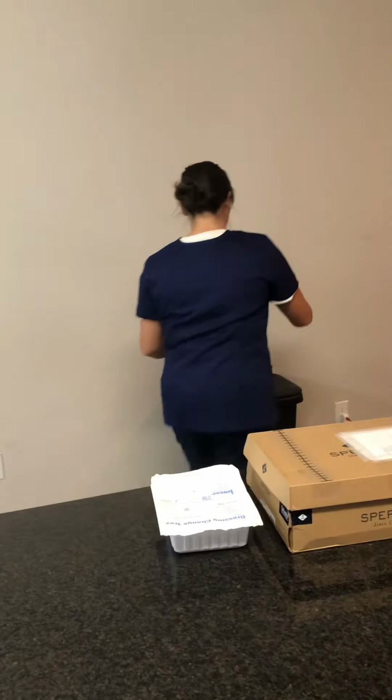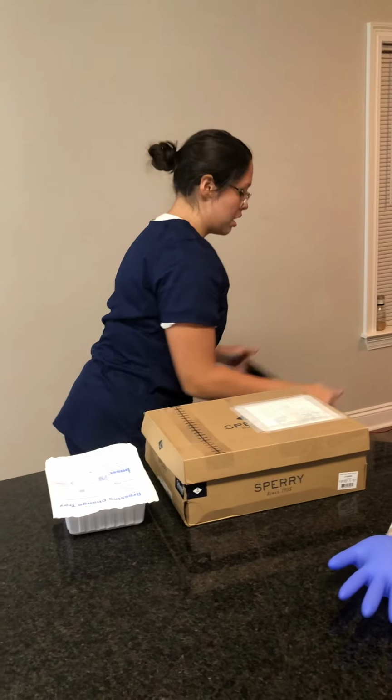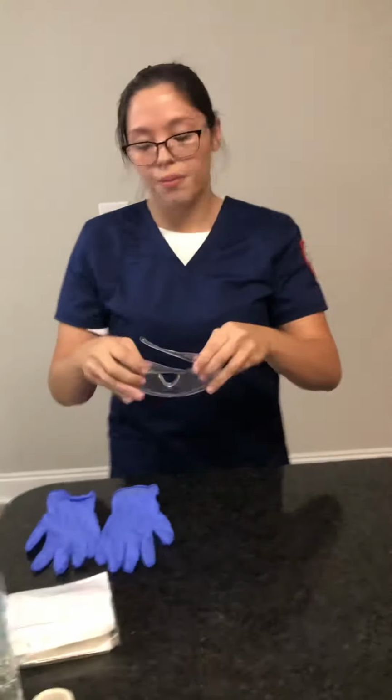I will then get my trash can and bring it to my work area and perform hand hygiene with the antiseptic hand rub. I will then heighten the bed to a working height and lower the side rails, as well as positioning the patient to a comfortable position. I will then apply my gloves and my goggles.